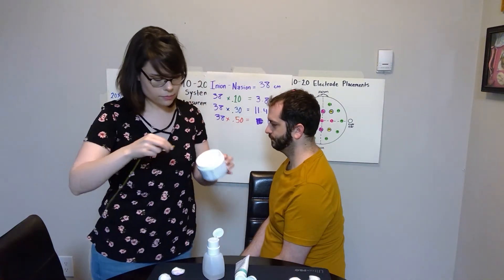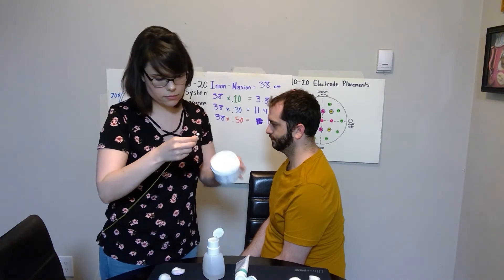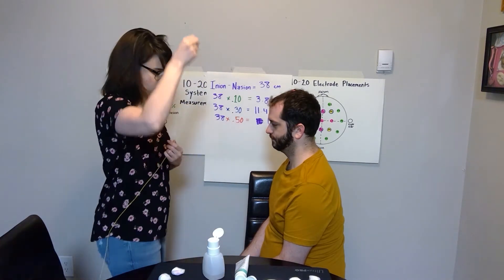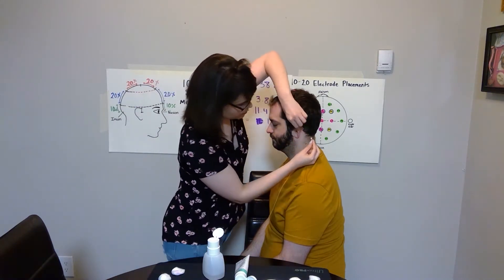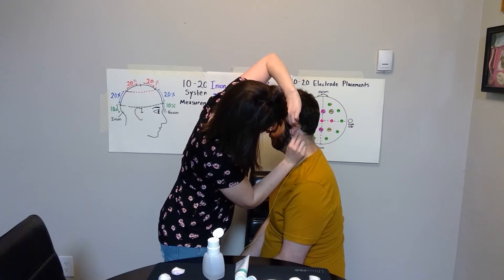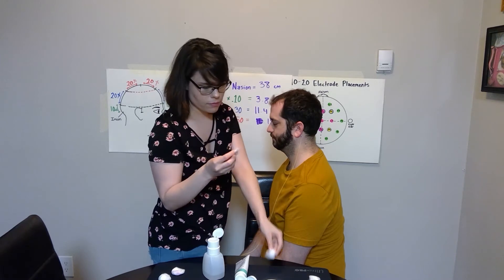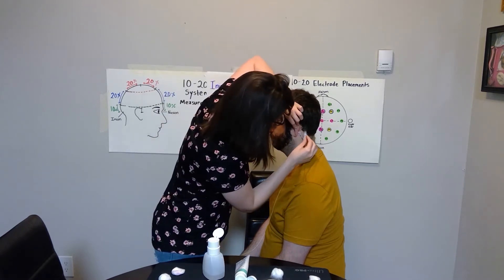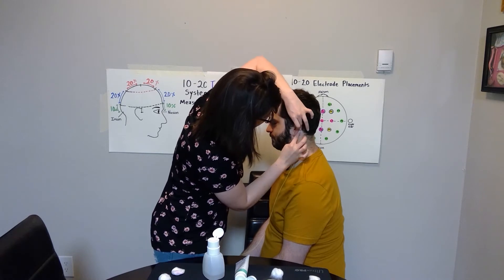Again, we're going to scoop on our 1020 paste and then press it firmly onto the mastoid. Press it down nice and firm.